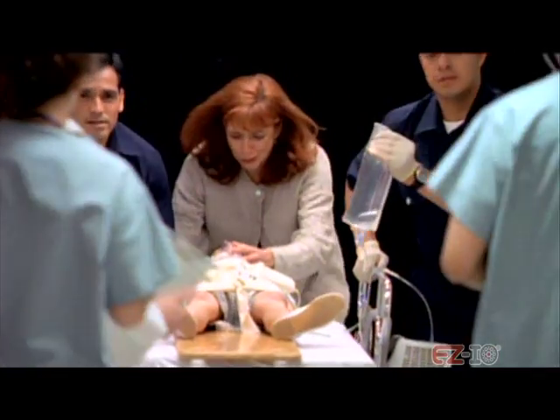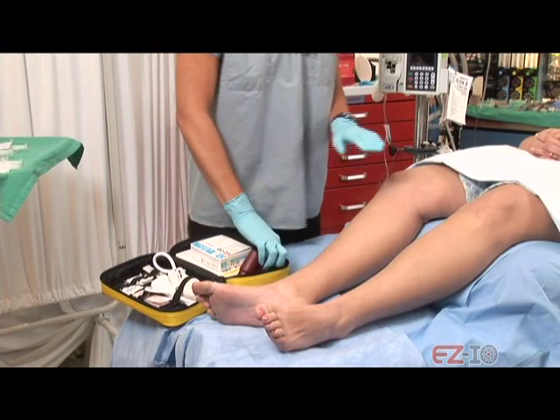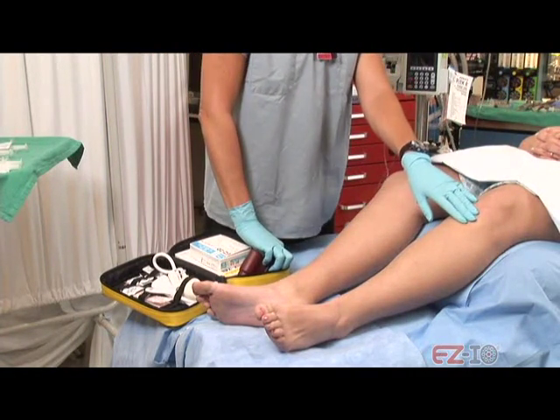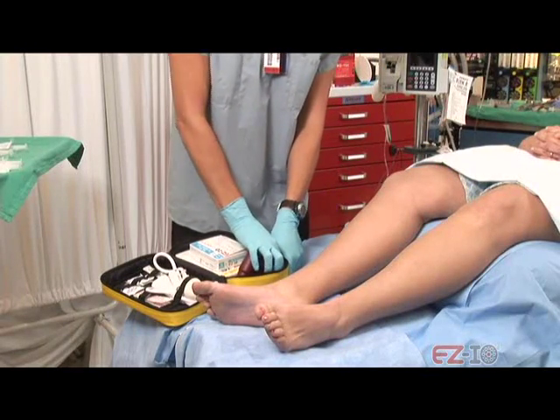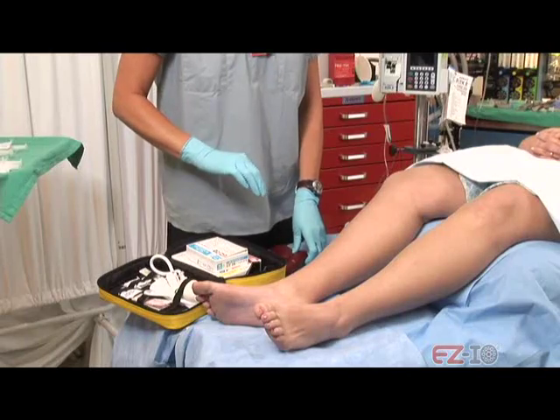I can't get a line. Somebody give me the easy I.O. Okay, I need to put a line into your leg — I'm going to put it actually into the bone. We can't get a line on you, an IV line, okay? Who needs an I.O.? I.O.